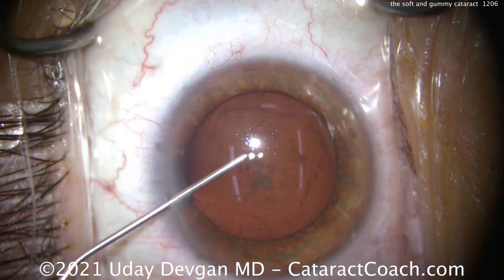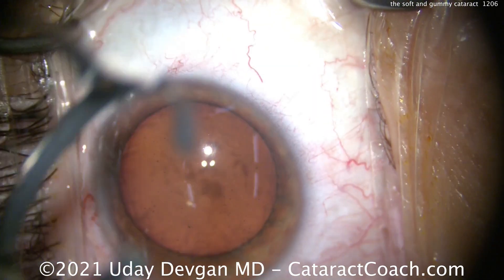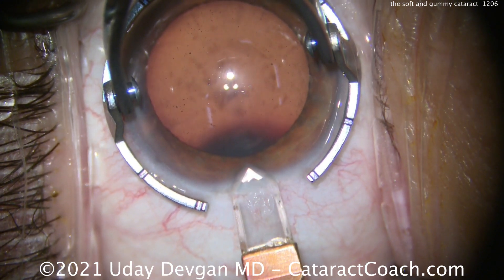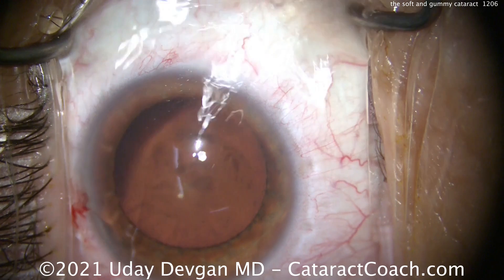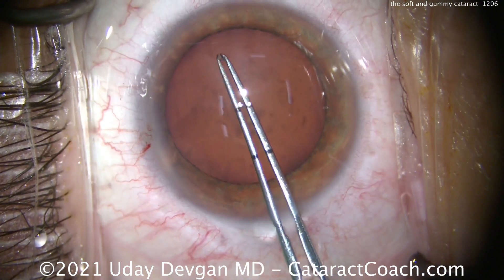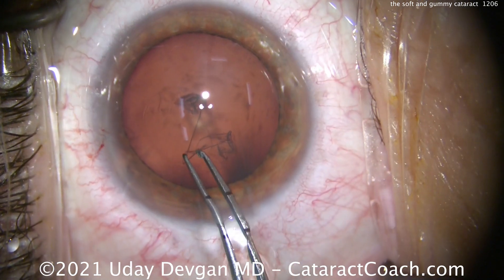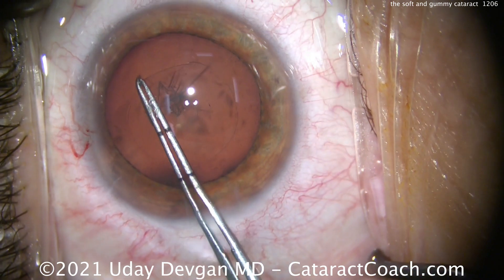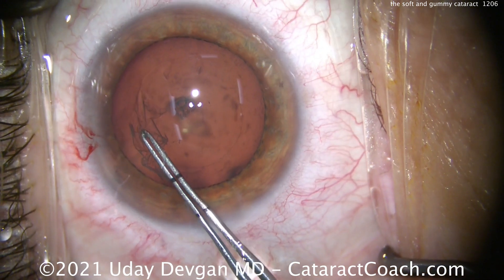This type of cataract has a lot of central or small opacities in it. There's some nuclear sclerosis, but the patient's on the younger side — about 55 to 60 years old — and there's not a tremendous amount of nuclear density here. The challenge comes in getting that nucleus broken up into smaller pieces because of its gummy nature. It's not super buttery soft like a young 30-year-old with a posterior subcapsular, and it doesn't have the density you'd expect in someone 70 years old with significant nuclear sclerosis. There's a mild degree of nuclear sclerosis, and you can see a lot of central opacities in this lens, which is causing the patient to have a lot of symptoms, especially with nighttime driving. This patient drives a lot at night for work.